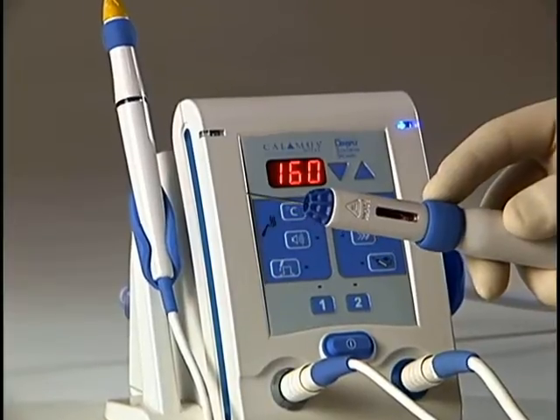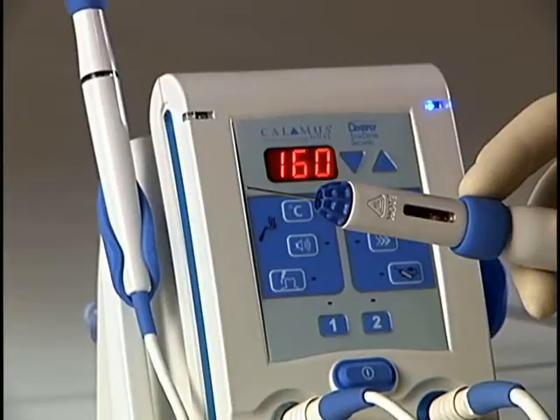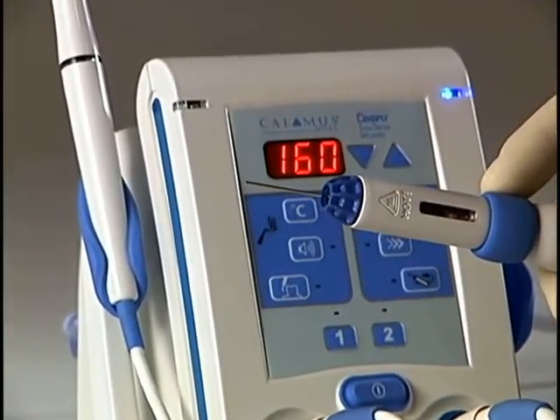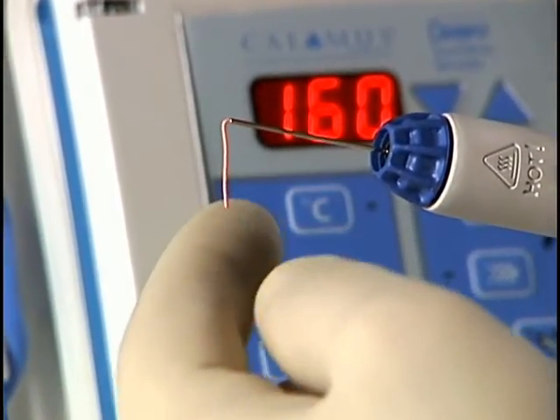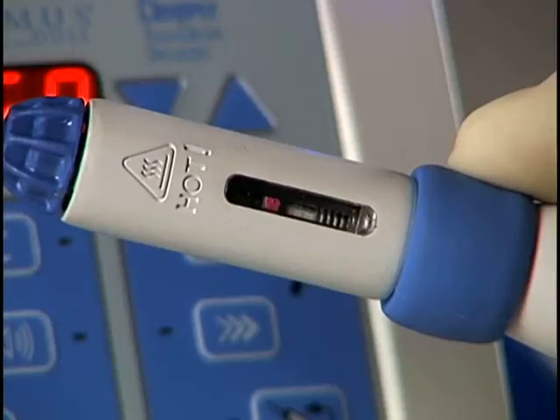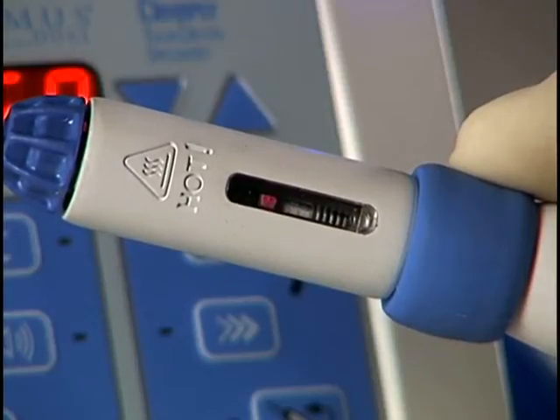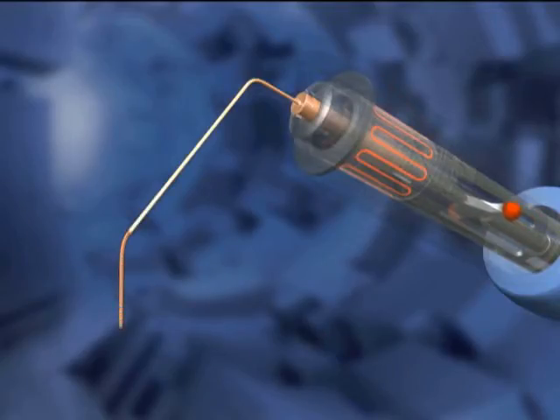Please note that after loading a fresh Calamus Singles cartridge, the user should press and hold the activation cuff for several seconds to re-engage the plunger and get the gutta percha flowing through the needle. The indicator in the window will move as the plunger advances toward the gutta percha in the cartridge. Once the plunger has engaged the gutta percha and an initial flow through the needle has been established, the indicator window will show approximately how much gutta percha is in the cartridge.